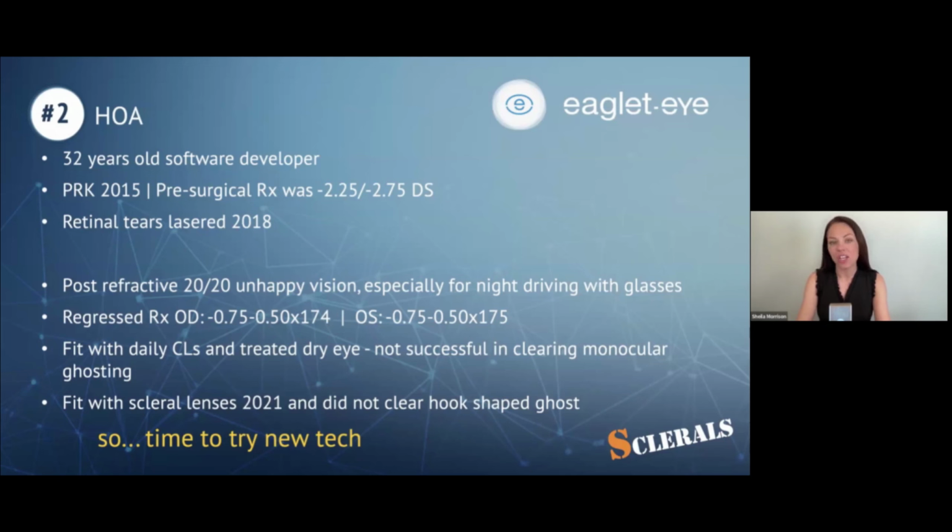And the challenge when trying to get the optic from an academic setting has always been translating an aberrometry scan into a scleral lens. It's hard. The lens fit is really, really important in that, number one, we need to have a stable device.